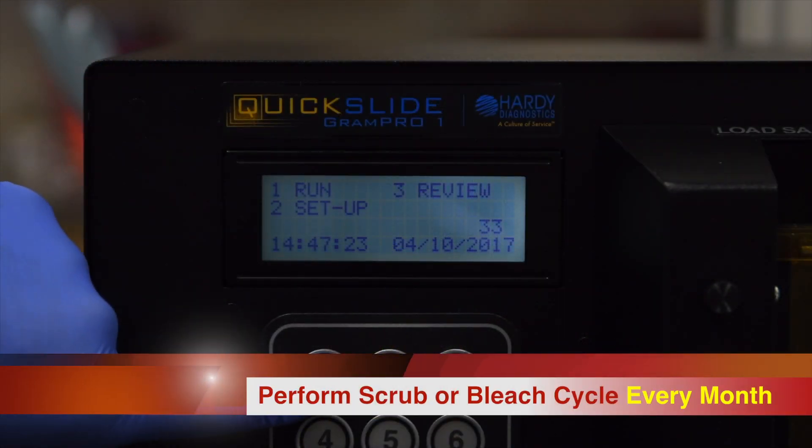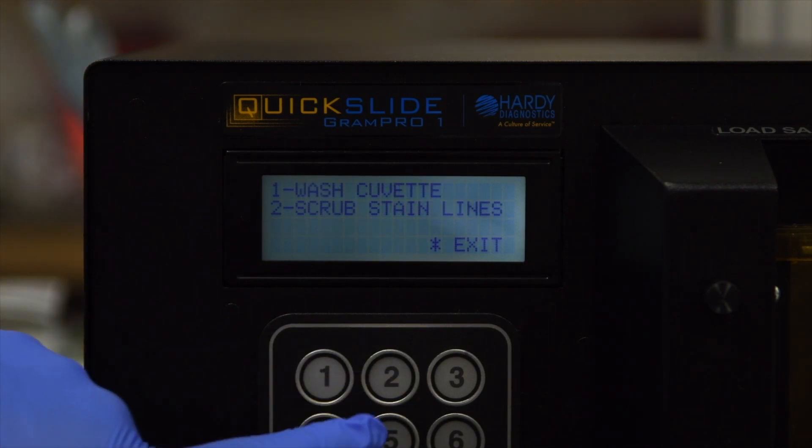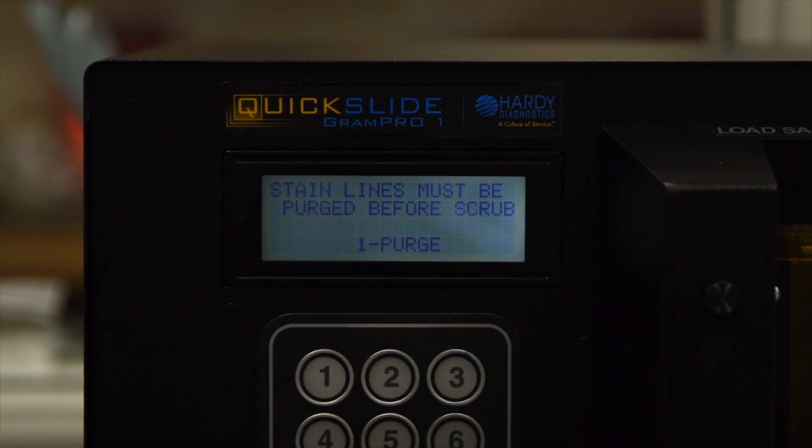Press 1 on the keypad to select Run. Press 2 to select Clean Cuvette. Press 2 again to select Scrub Stain Lines. When prompted, press 1 to select Purge.